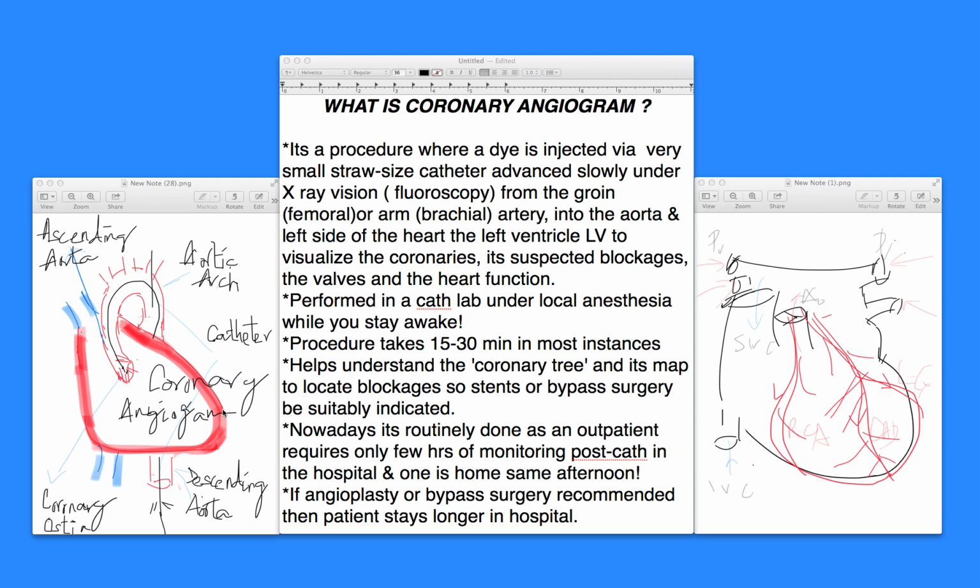However, after the procedure, if it's done from a femoral approach, you're required to lie in bed with a small sandbag on the groin artery, resting like a baby there. The reason is that you certainly want to have good hemostasis and good control, because once you begin to walk, you want to be sure that it's healed well. So normally it takes about 4 to 6 hours roughly, while you're in the hospital lying in bed with that so-called sandbag on your groin area, to compress the artery and make sure that it is nicely healed.